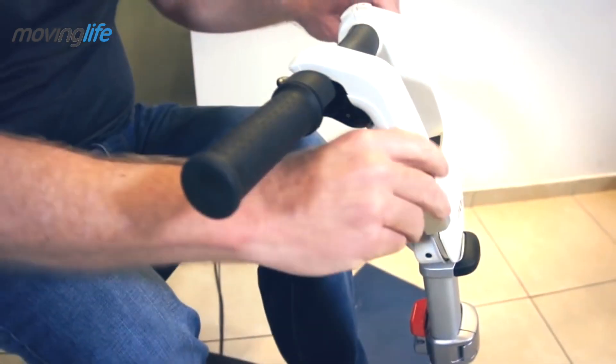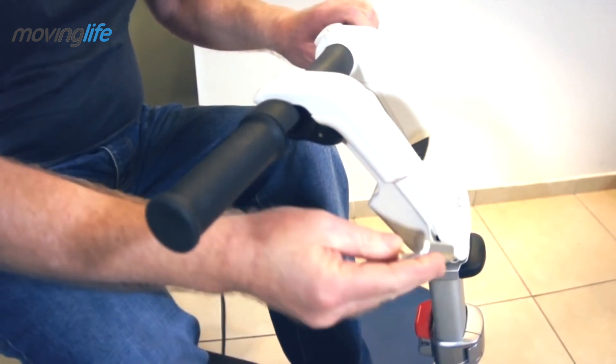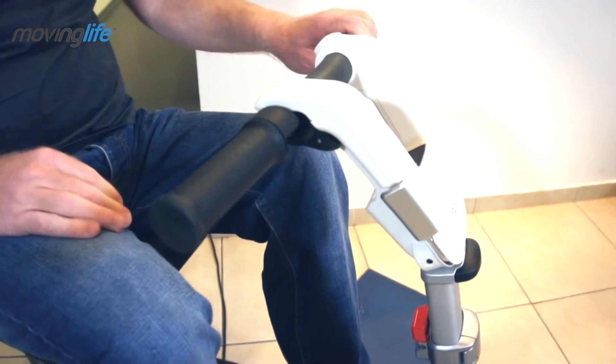Driving console angle adjustment is done by releasing the lever, adjusting the angle, and tightening the lever in the required angle.